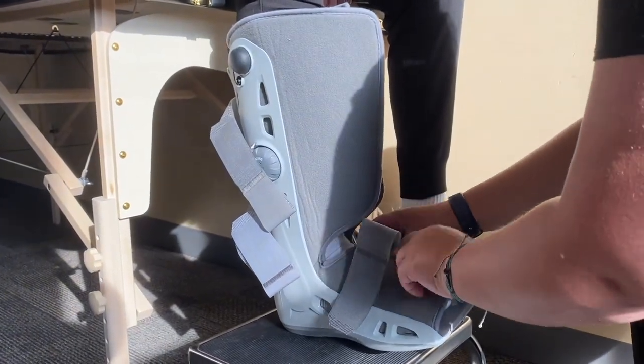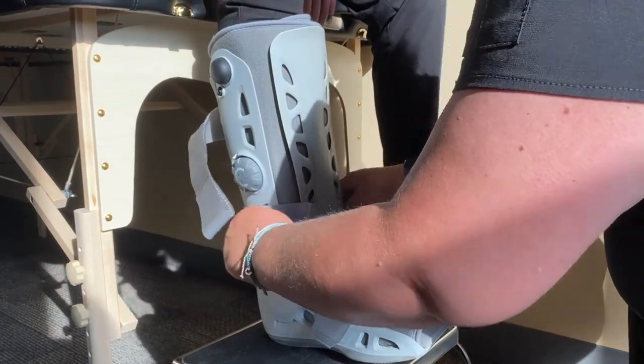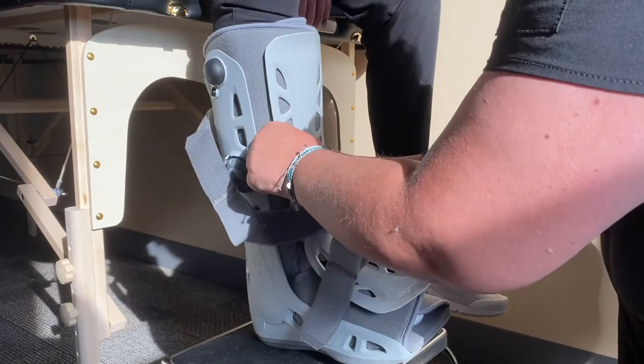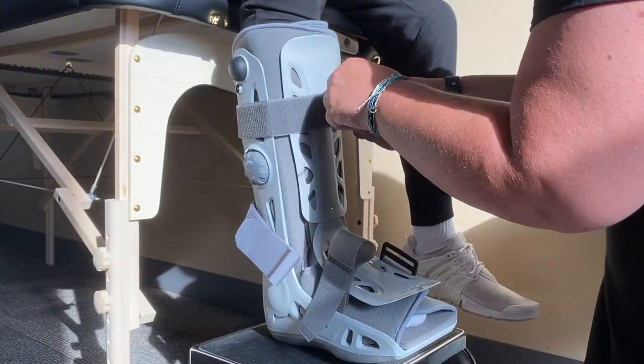Next, wrap the liner around your foot and leg and secure it in place with Velcro tabs. Then, replace the protective front panel. Lastly, secure the straps by lacing them through the buckle over the protective front panel. On the standard height boot, you will have three straps to fasten. On the short height boot, you will have two straps to fasten.